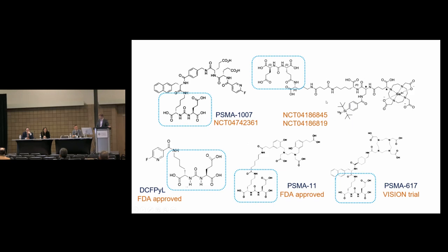This is rhPSMA 7 on the top right here, and this is also in phase 3 trials that actually have complete enrollment. It was presented at ASCO GU this year, and I'm sure there'll be follow-up data on this agent at ASCO in a couple weeks.